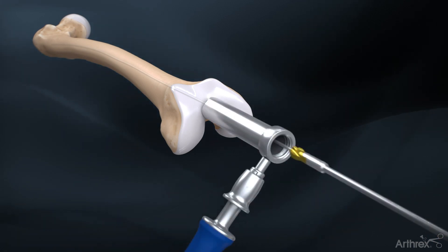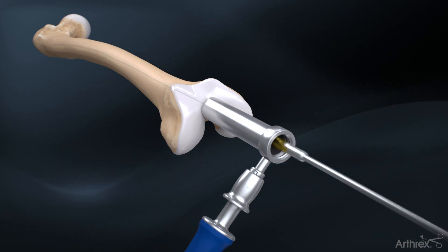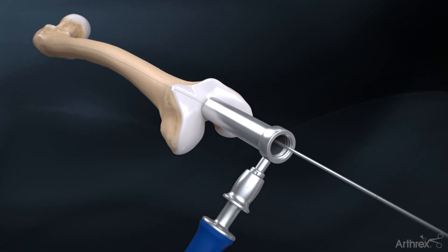The 8 mm end cutting reamer is used to ream out the central path for the nail. Sequentially ream until cortical chatter is achieved. It is recommended to ream 1 to 1.5 mm over the desired nail diameter.